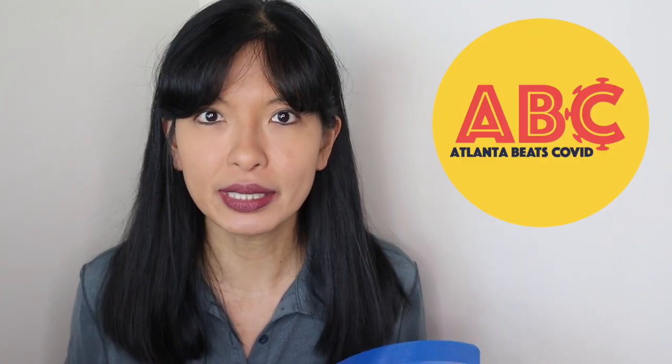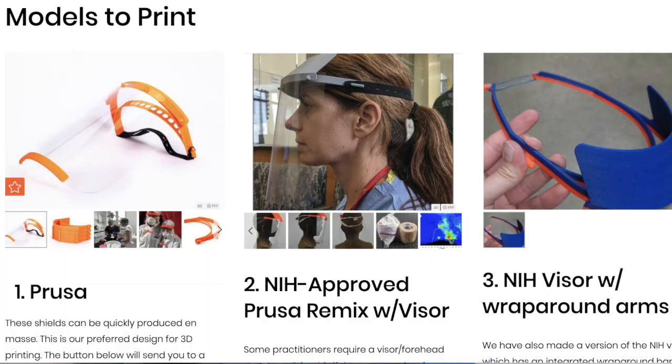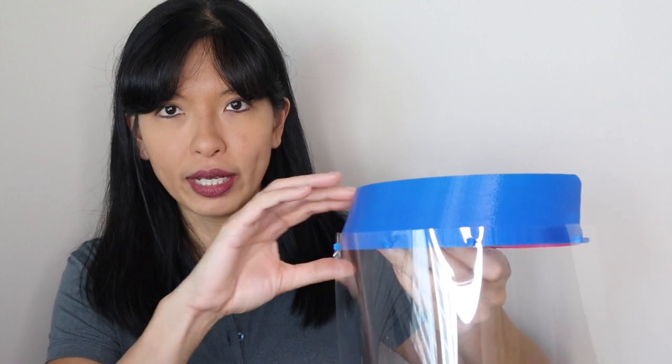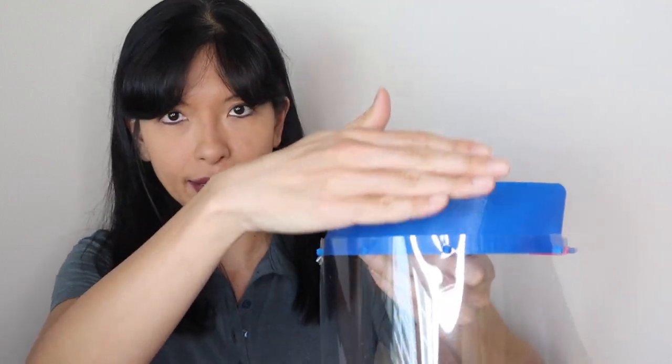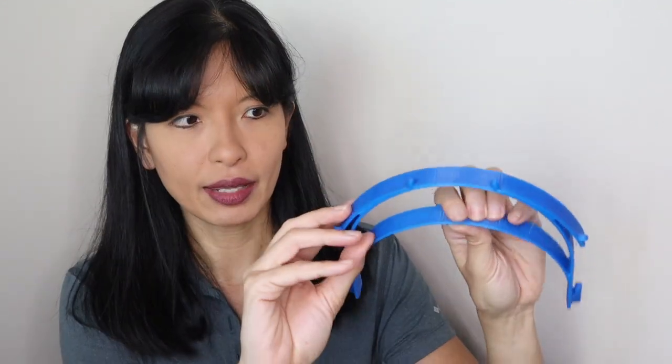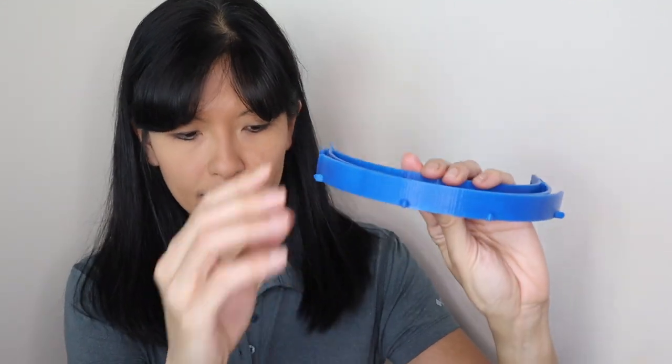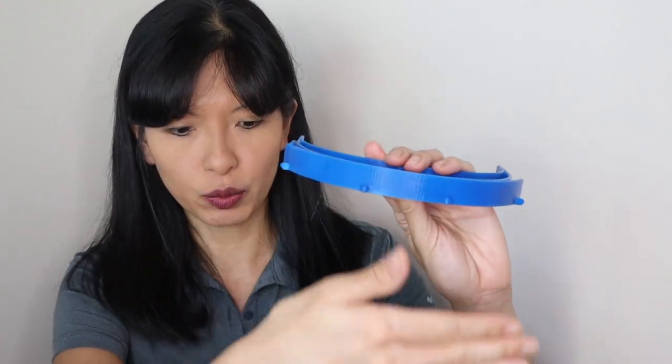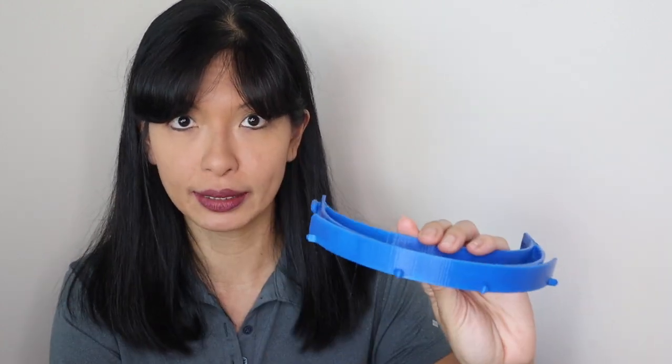There are a bunch of different designs out there. I'm working with Atlanta Beats COVID, ABC, and they have settled on three different designs. You can print any of these designs that you want, and then drop off your prints at their specified locations. Now, this one has a shield visor type, and then this one doesn't have that shield on there, and then you would put the clear plastic part.